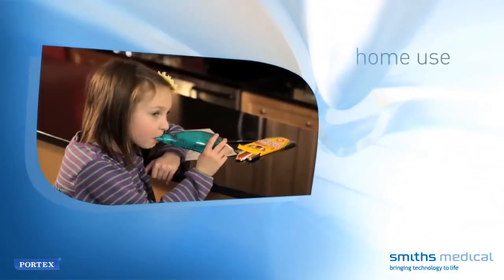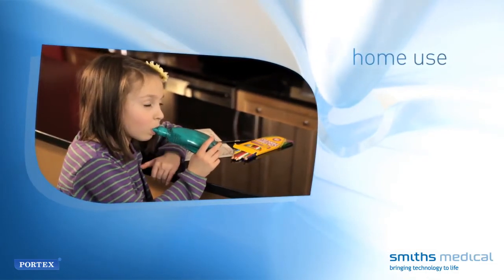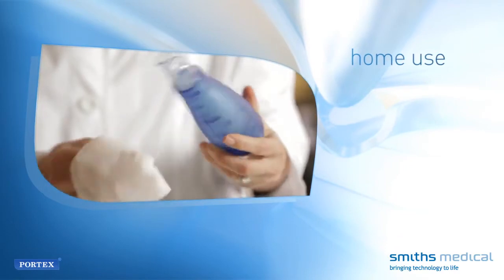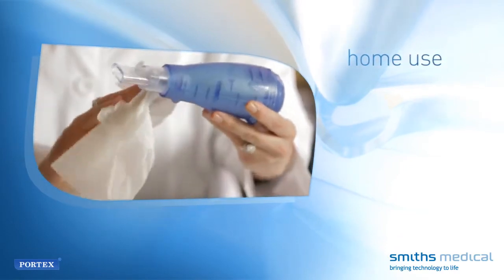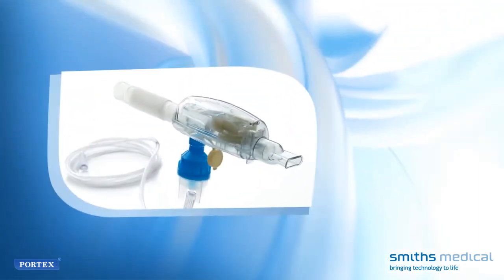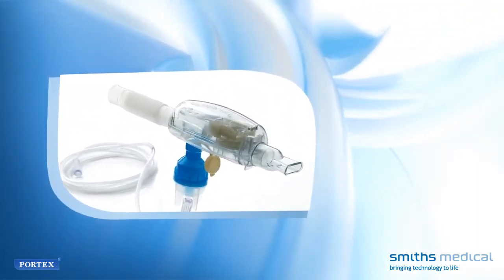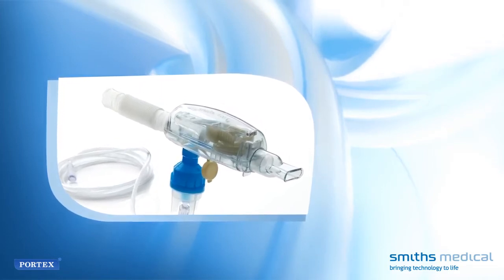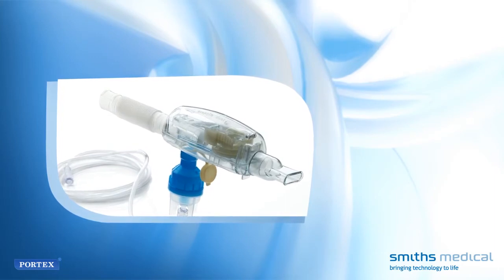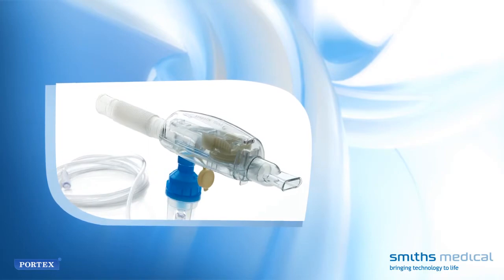Home use. Clean the device after each therapy session to prevent the growth of bacteria and disinfect it daily. The outside of the Acapella device should be cleaned with a mild household soap. Bleach should not be used. If the Acapella is used with a small volume nebulizer for the administration of medications, it should be cleaned and disinfected daily, applying the practices recommended by the Cystic Fibrosis Foundation for stopping the spread of germs.